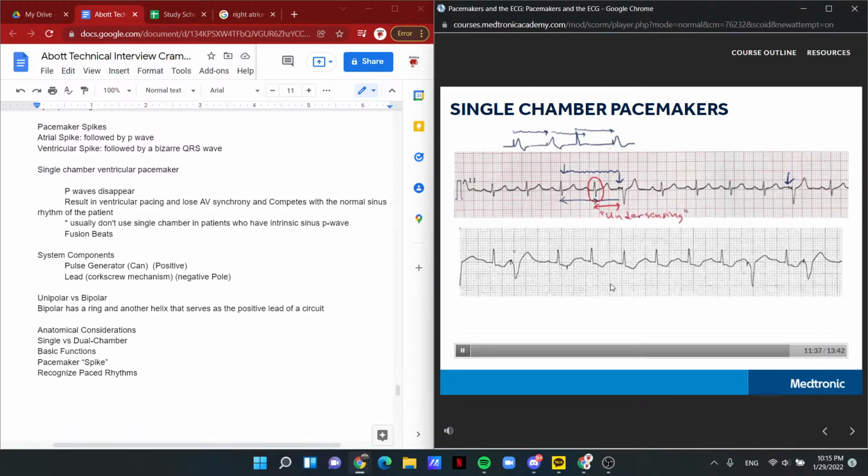Here's a very obvious example of undersensing, with pacemaker spikes occurring right after an intrinsic QRS complex. And in fact, this spike lands on top of the T wave. If we again use a pair of calipers and set it for this interval between spikes, we can see that this interval is the same. If we measure back from the spike, it appears that the pacemaker probably sensed this beat, but did not sense this one. However, there are no other spikes in here, and so it was inhibited by some of these beats. So what we have here is intermittent failure to sense, otherwise known as undersensing.